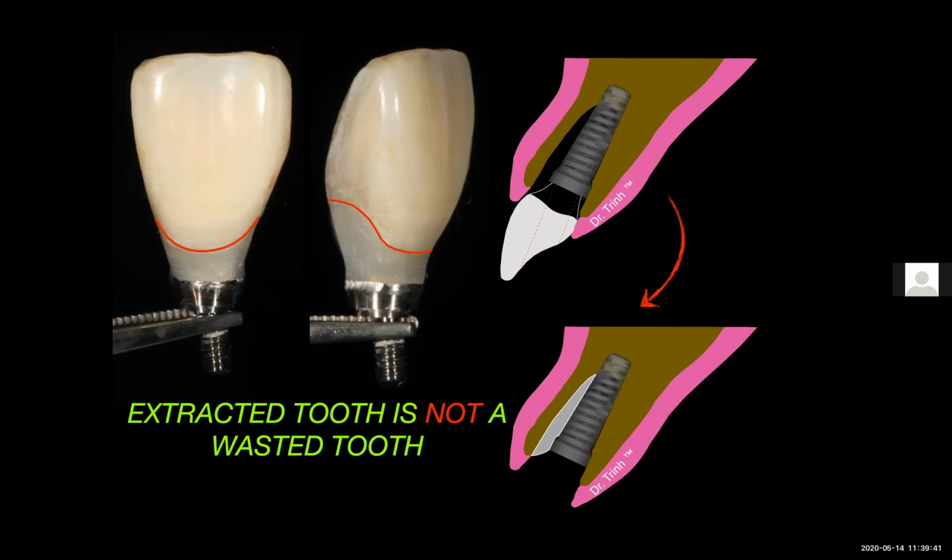To be honest with you, this takes no more time than the conventional provisional technique. Based on my experience, this technique probably takes less time because you are not starting from scratch. Remember, folks, you can charge for this procedure just as you charge for any other procedure, and you set a fee for this particular service depending on your practice location.